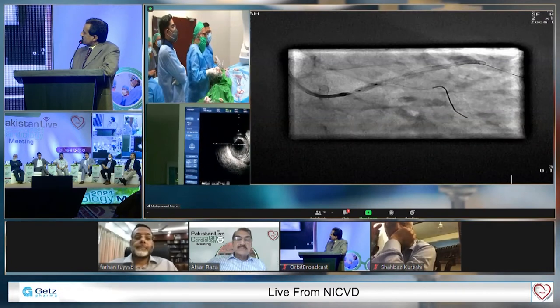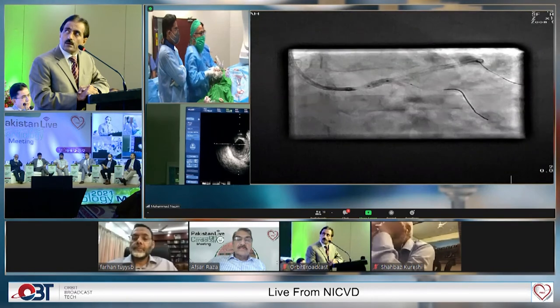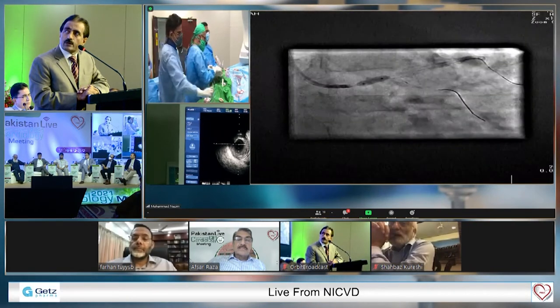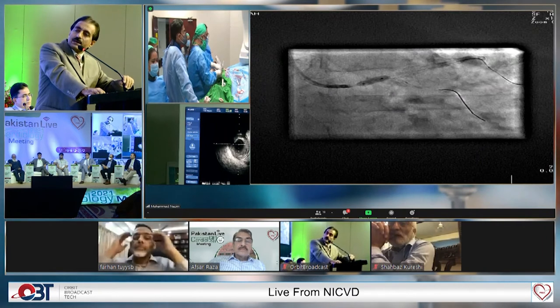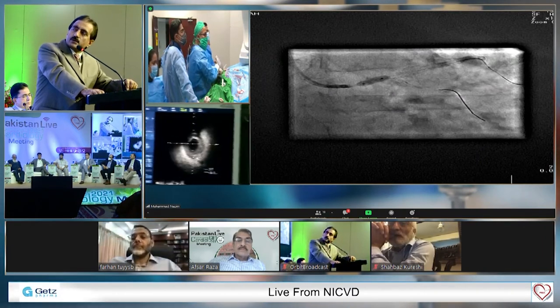I think the circumflex ostium was clear of disease. If there is no significant flow problem and no critical narrowing, then it may be left alone. You may not have to go for another stent there. But let's assume if you have to put a stent in there, sir, what would you do?